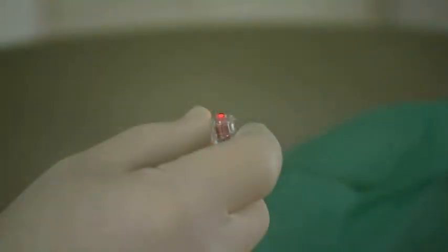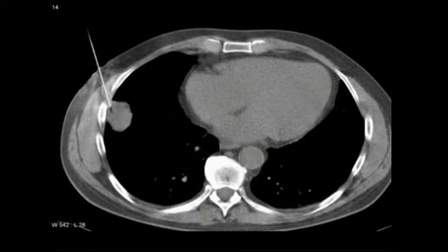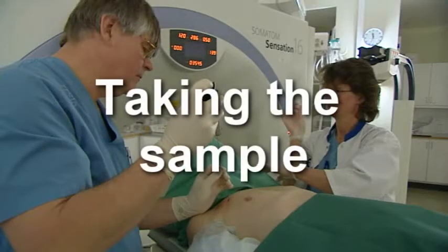Enter the needle in one swift motion to the correct depth, keeping the laser dot at the hub of the needle before scanning the patient to make sure the needle is placed correctly. When this is verified, the sampling may take place.